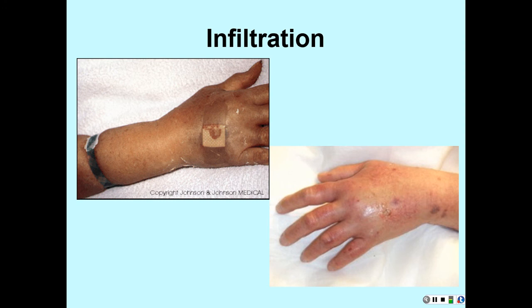So when your patient complains of those type of issues, tingling, burning, you have to assess it. You have to assess it. You have to see, do I have blood return? Is it flowing well? And what you do is you take it off the pump and you open it up to see, does it flow? If it doesn't drip, something's keeping it from dripping.